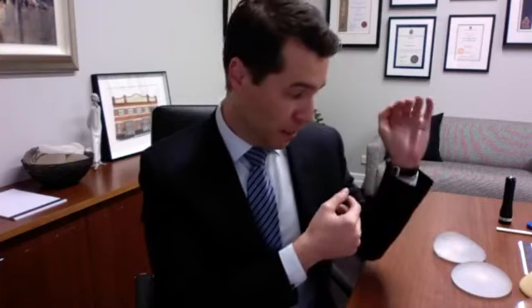So yes, the question: are all textured implants bad? The answer is no. We've got a grading system looking at macro, micro, nano-textured surfaces and smooth, leading from 4 down to grade 1, which is a smooth. The Motiva is also categorized as a smooth, essentially, in that grading system. And they carry a monumental decline from 1 in 3,600 down to 0, depending on the texturing involved.